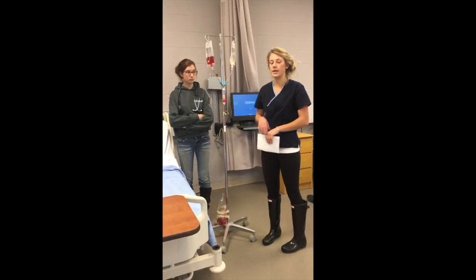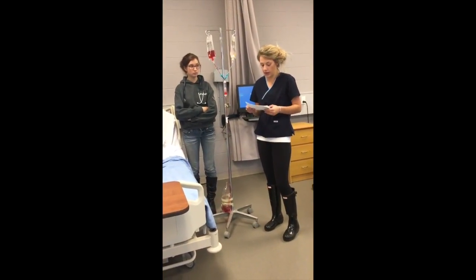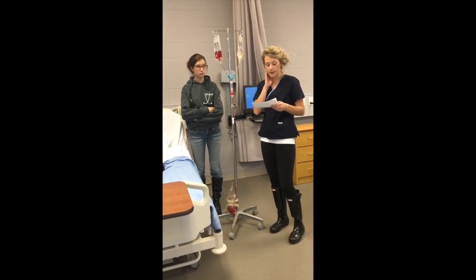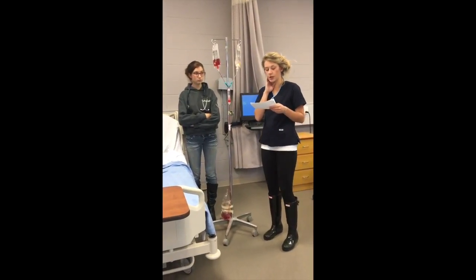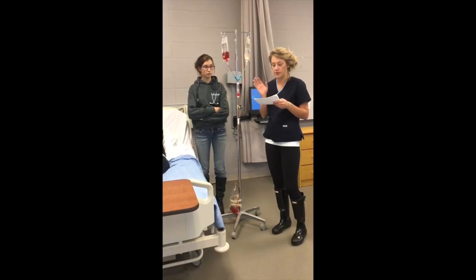So when we're checking the site of insertion every 15 minutes, we're going to be looking for any discomfort, phlebitis, infiltration or inflammation, and we'll also be checking the pump to ensure that we have a patent line, flow rate, and the infusion amount is correct.